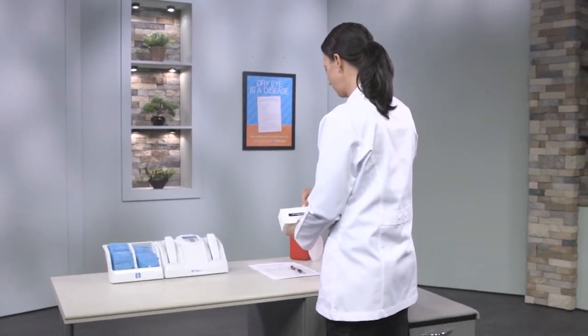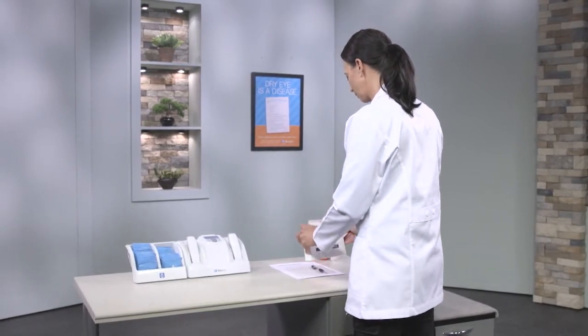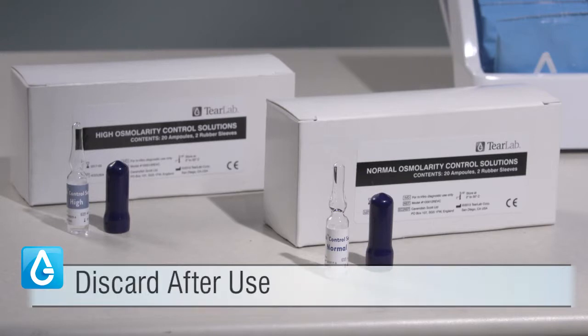The osmolarity control solutions should be at ambient or room temperature when testing, and they should be discarded appropriately after use. An open ampoule should not be stored for reuse at a later time.